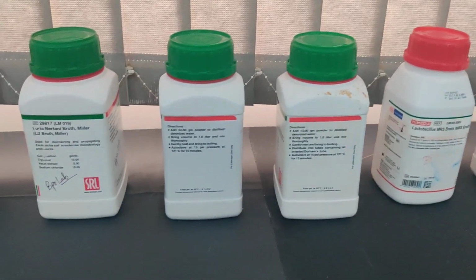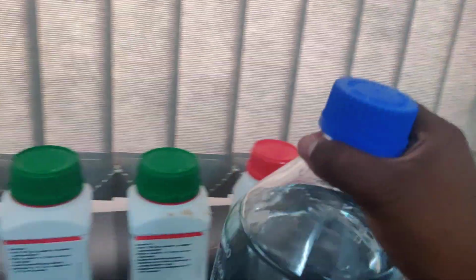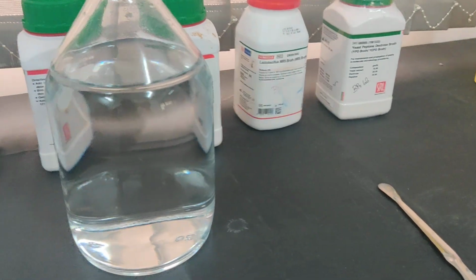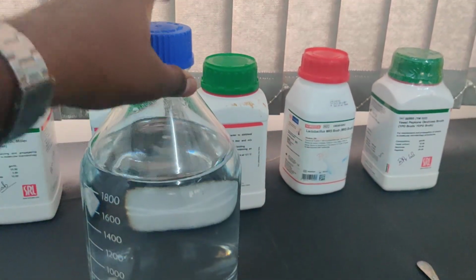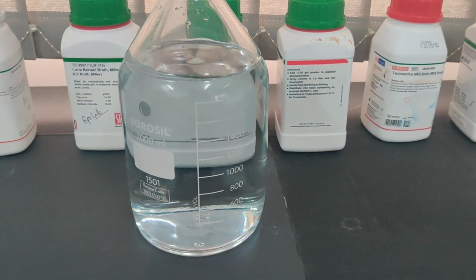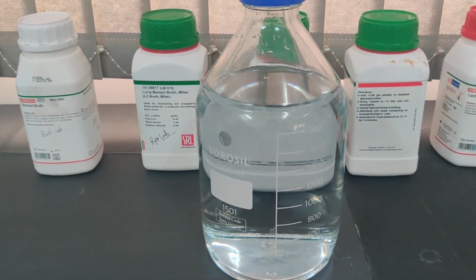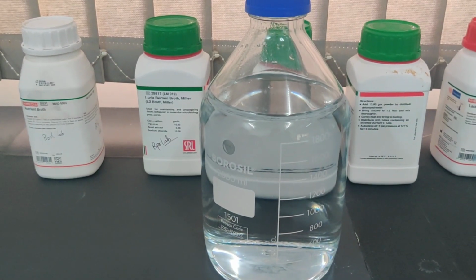dissolve it using distilled water. We have distilled water here. So you have a distillation apparatus. Distilled water is devoid of any other minerals, only H2O. The water that comes from our tap is not distilled water. It is not completely pure water. It will have some minerals which are required for human life. So we have an instrument, a distillation unit, for preparing this distilled water. With this distilled water, you have to prepare this medium. Okay, you have to weigh the required amount of medium, and then you have to prepare this accordingly.